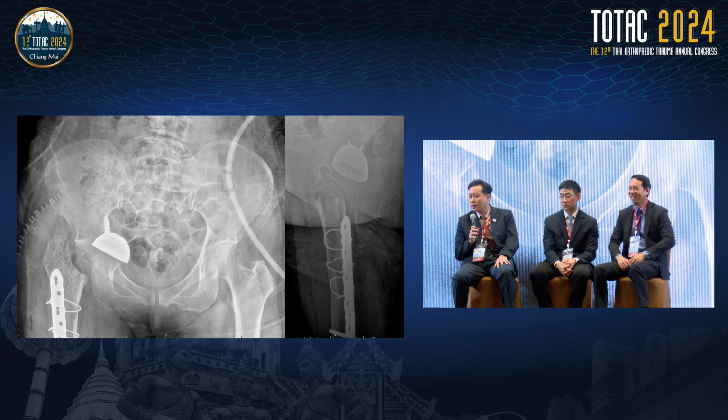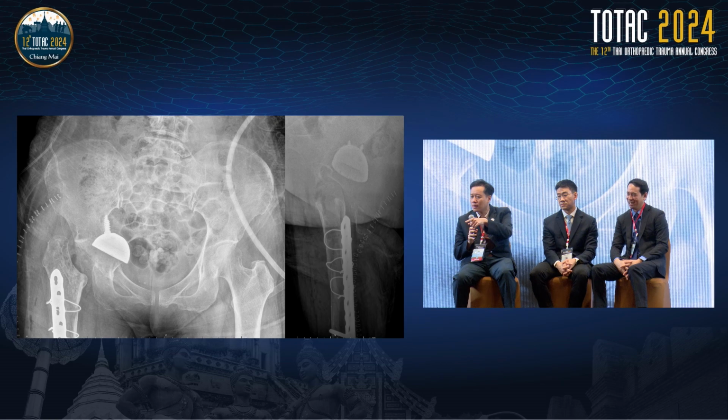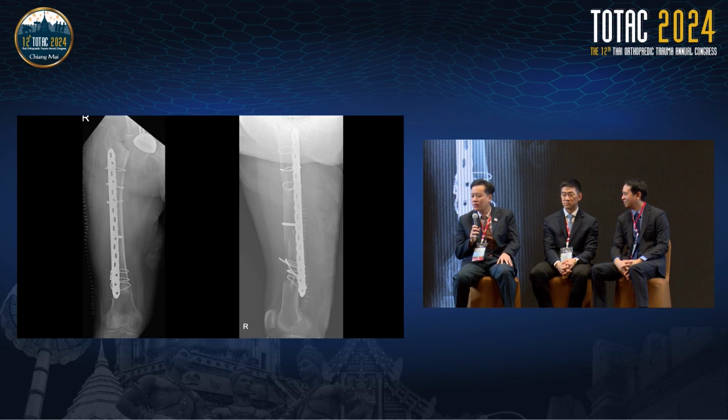So I'm quite worried, maybe go to the long X-ray of the femur. I think it is quite difficult to try to fix with similar stems as the panel mentions, because it's quite hollow at the femoral canal, and I'm not quite sure whether the Wagner stem would be possible to fix the rest of the area and secure the load transfer from the hip to the knee.